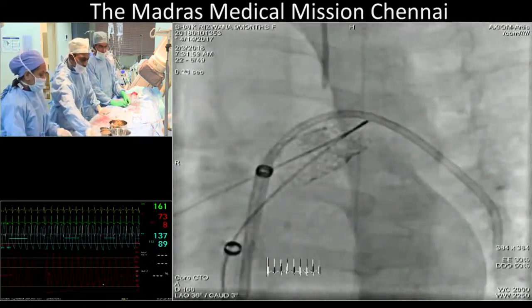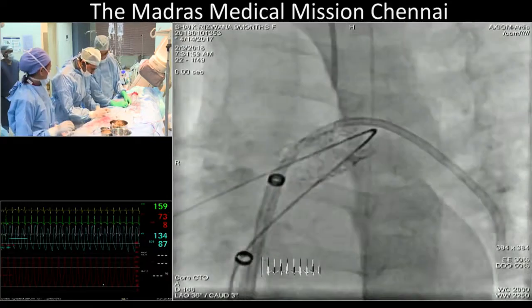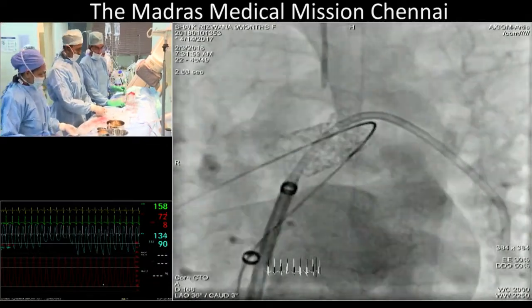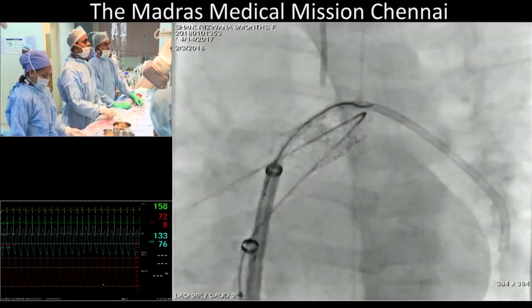Yeah, but now he's stented the right. There's no harm in stenting the left. Maybe the Formula 18 doesn't really go to a great dimension. Formula 35 would be a bit more. 8 would go up to about 14 maximum, I think. Yeah, at a real stretch.